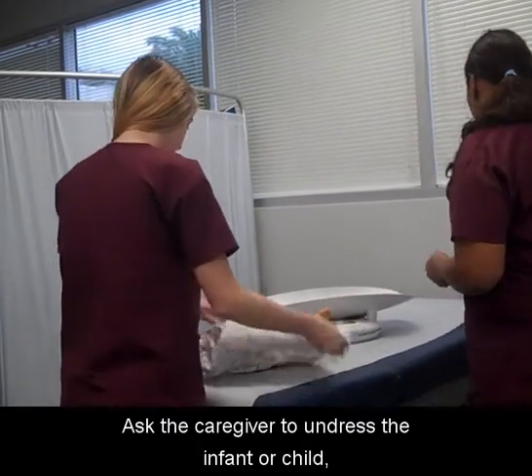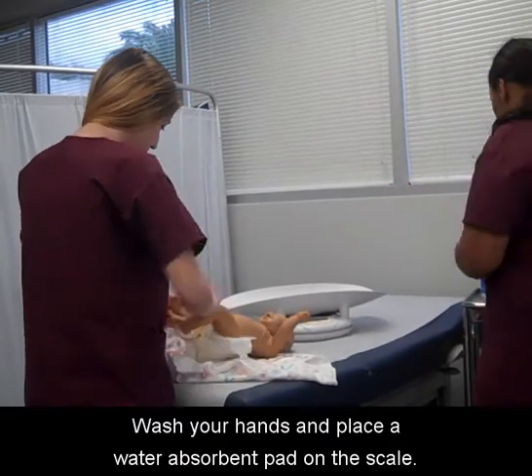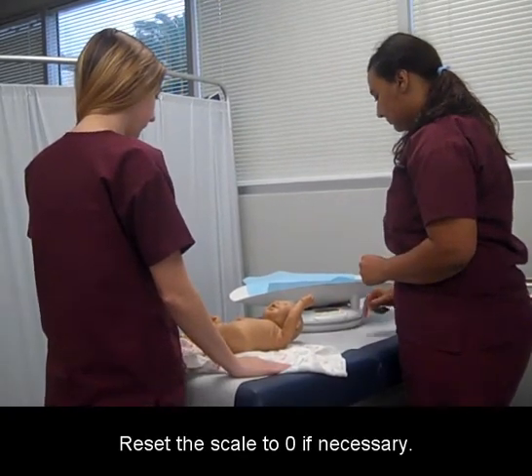Ask the caregiver to undress the infant or child, including the diaper. Wash your hands and place a water absorbent pad on the scale. Reset the scale to zero if necessary.